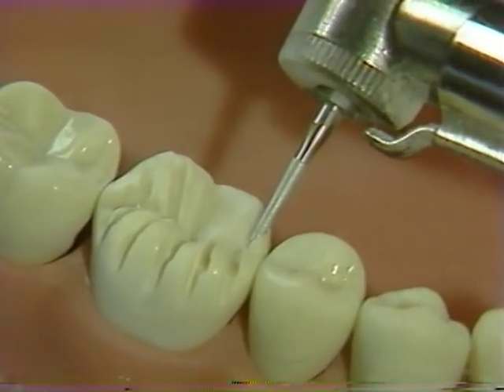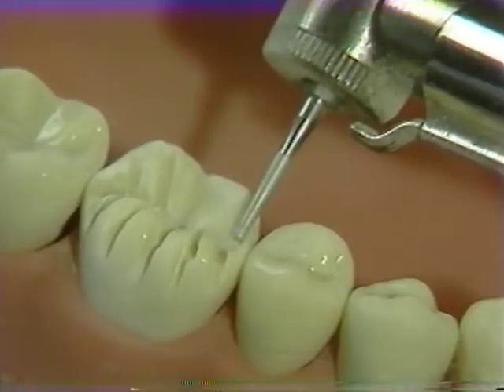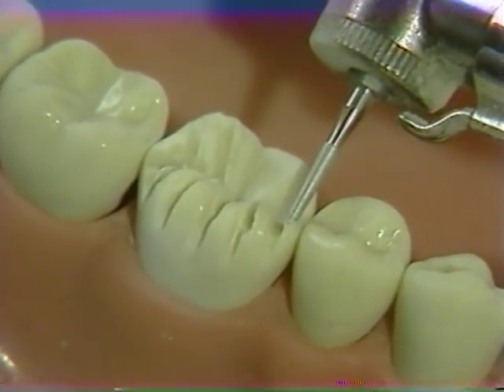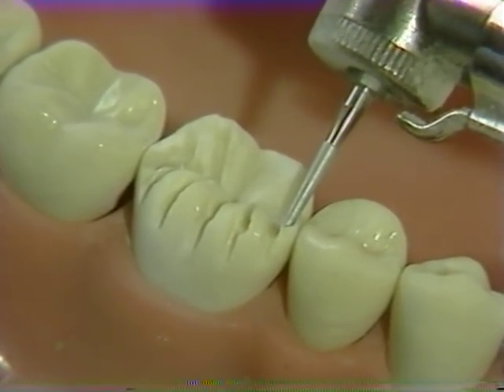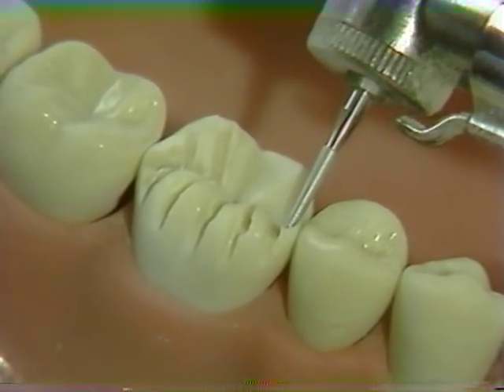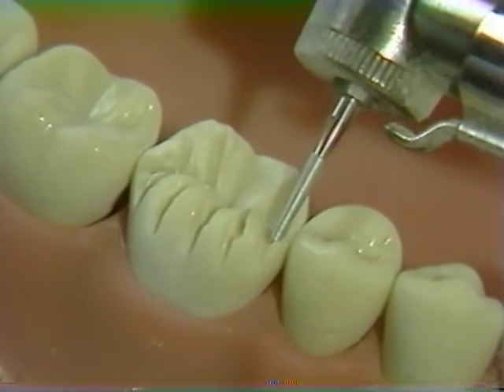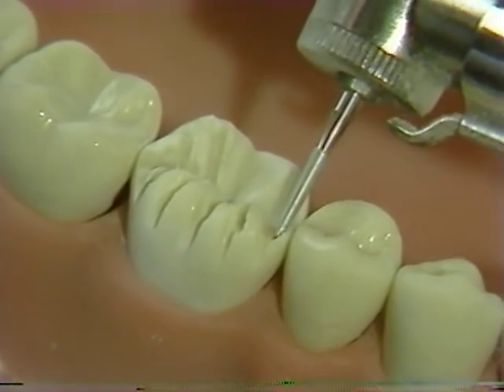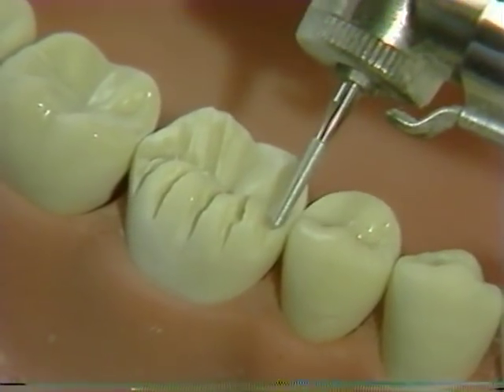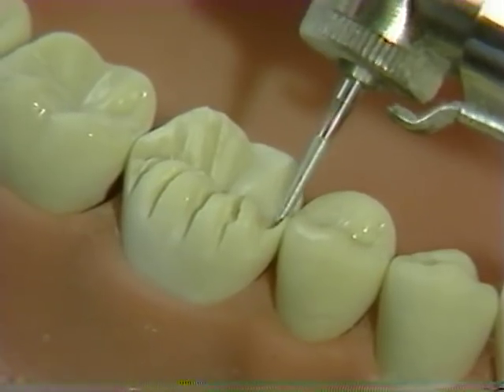In the area of the marginal ridge, it may be somewhat tricky and it may be desirable to leave a very small amount of tooth structure immediately in the area of the contact point. The completed reduction, however, should allow for at least one millimeter clearance by comparison to the adjacent marginal ridge.